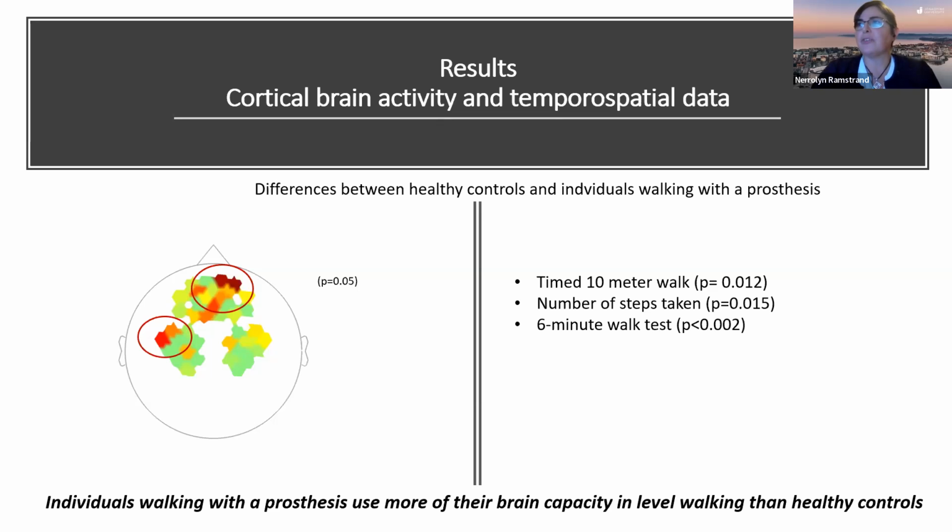We also saw differences in time in 10-meter walk tests, in number of steps taken, and 6-minute walk test. I don't think anyone would be surprised at all by those results. What is interesting, though, is that we can very clearly show that our prosthesis users require more cortical, or more attentional, demand. So they're thinking more when they walk.